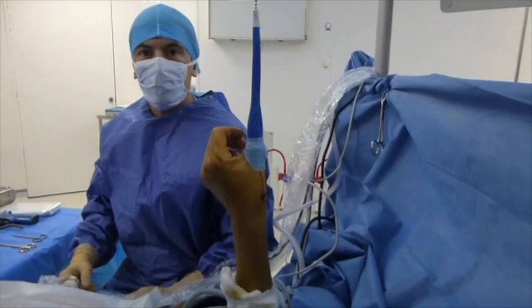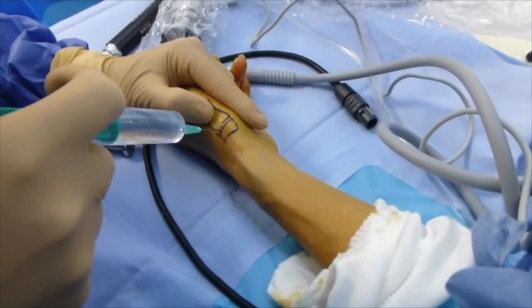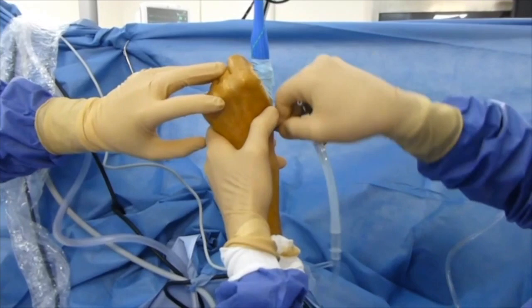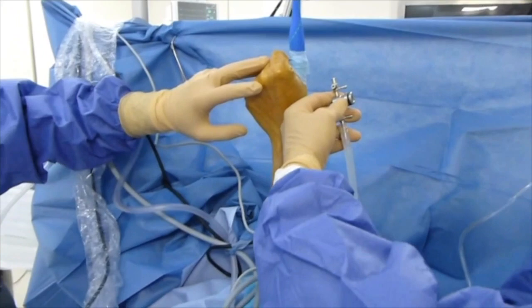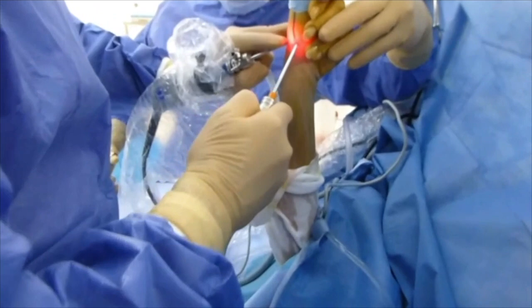Intra-articular introduction of 25-gauge hypodermic needles allows the correct positioning of the entry point to be verified by fluoroscopic control. This allows us to avoid making a mistake with the scaphotrapezial joint, which is very close. Drawing the skin incision and bone relief after careful palpation may be useful before applying traction.